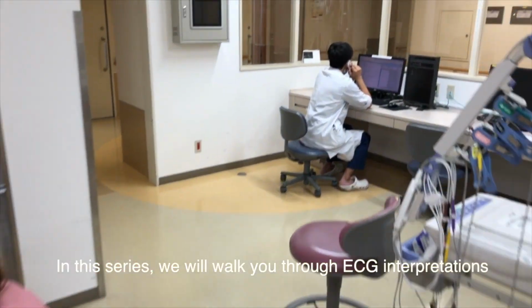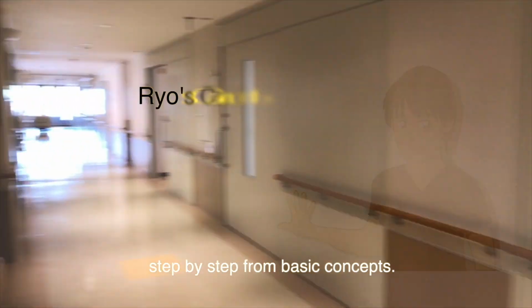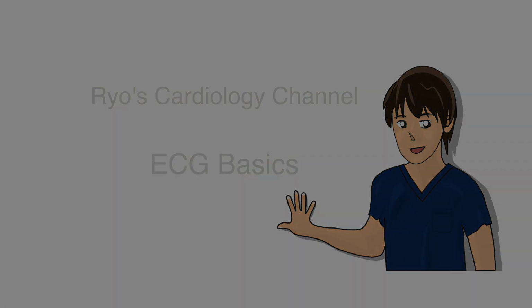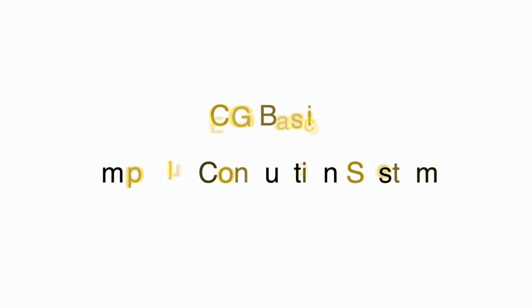In this series, we will walk you through ECG interpretations, step by step from basic concepts. The first episode here is ECG Basics. Let us begin with the impulse conducting system.